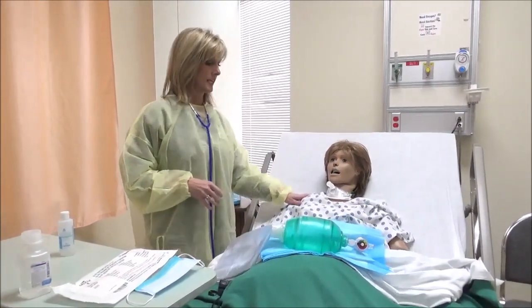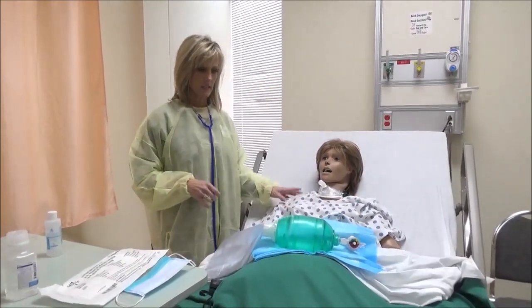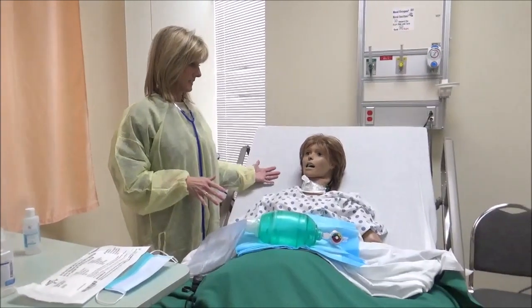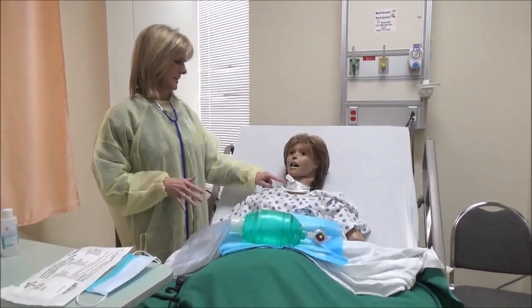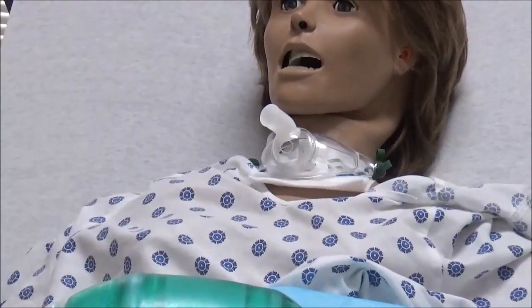Okay, so this is going to be trach care suctioning for your fourth semester competency. So I have come into the room. I already have my client in a mid-Fowler's position. They have an oxygen source of trach collar, and I have assembled my equipment.